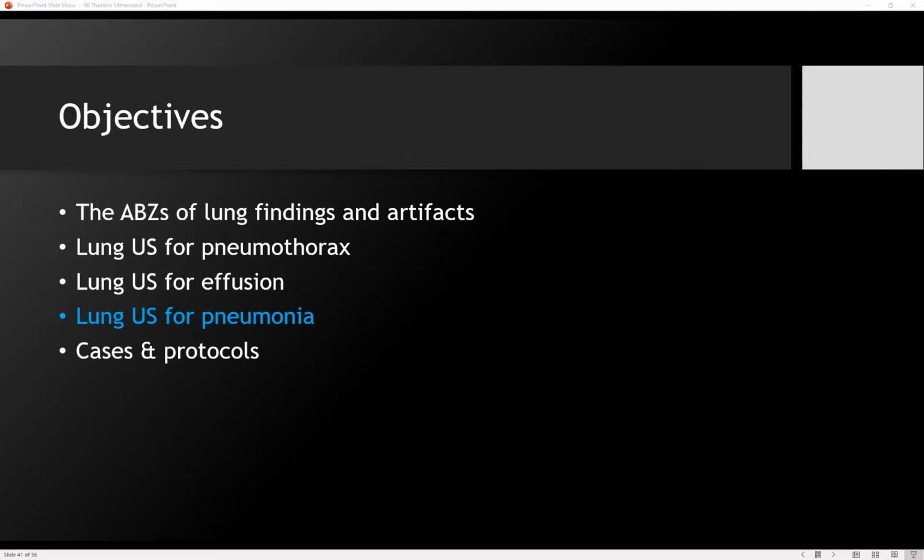Yeah. I would try out the lung preset, it oftentimes will bring out the B lines. That's helpful. Thank you. Yeah. That's great. Thank you. All right.